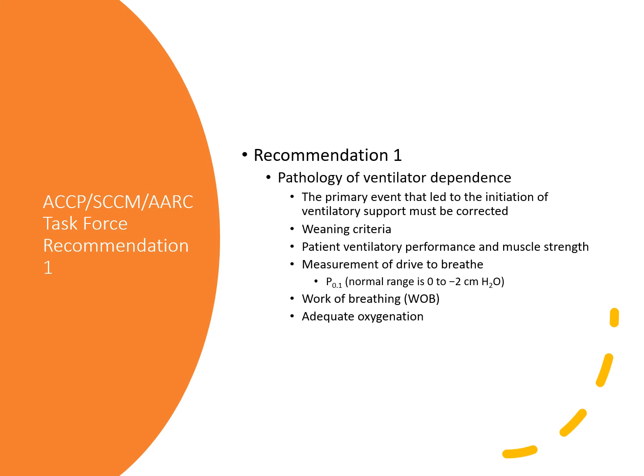Often, weaning criteria can be met on most patients, like what I was saying earlier. About 75% of patients who meet weaning criteria usually will tolerate their initial spontaneous breathing trial, and establishing a wean for their vent discontinuation could be successful. But even among patients who never satisfy weaning criteria, right? About 30% of them can be weaned from the ventilator. So sometimes it may not look pretty, but it may still be a very stable process.